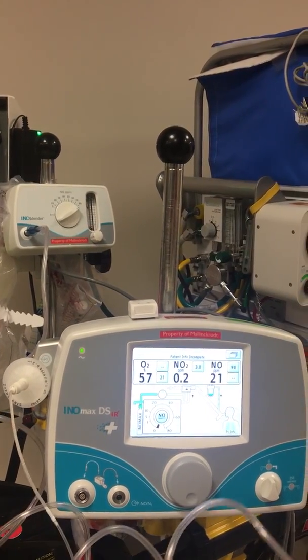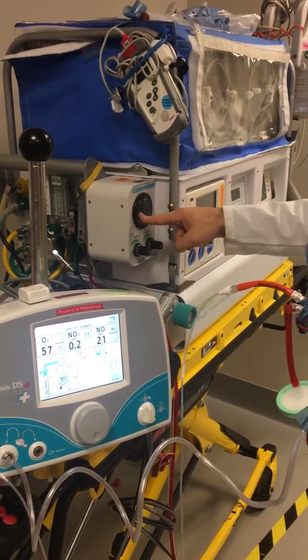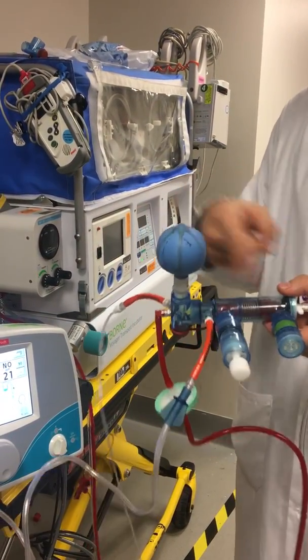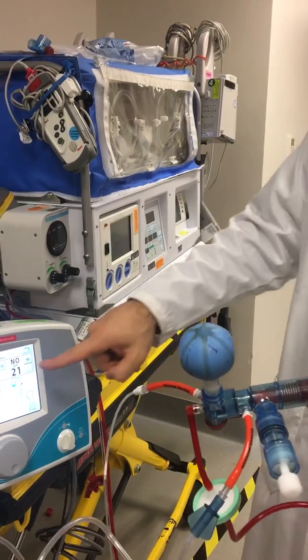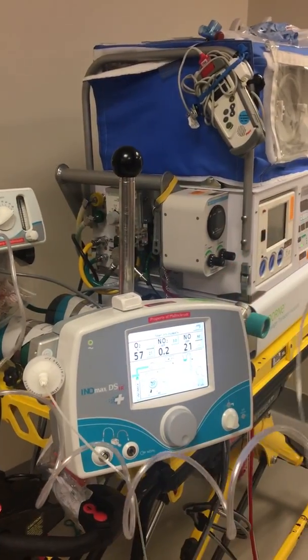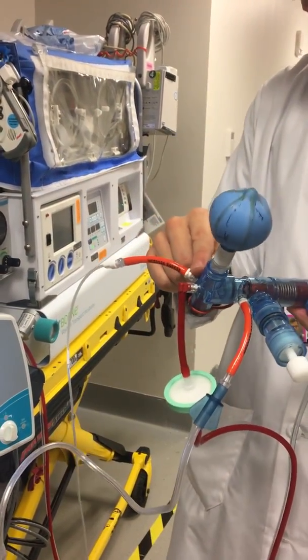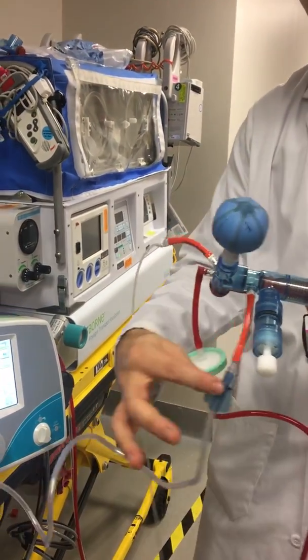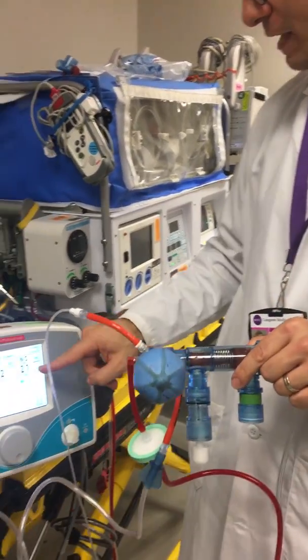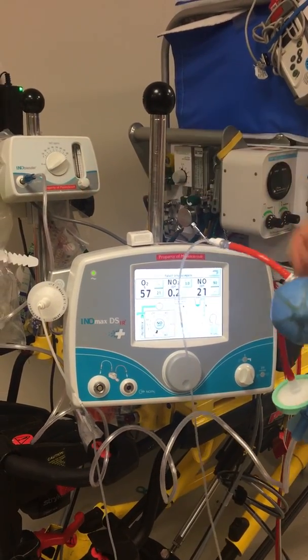Now we're ready to put this on a patient because we've set our frequency, our mean airway pressure, and our amplitude for the phasotron and the high frequency circuit, and we have the nitric oxide delivering and sampling as close to the patient as possible. We know we're delivering the accurate amount of nitric and delivering right under here. It's hard to get a perfect number sometimes — 20, 21 — but we can still manipulate that as needed.